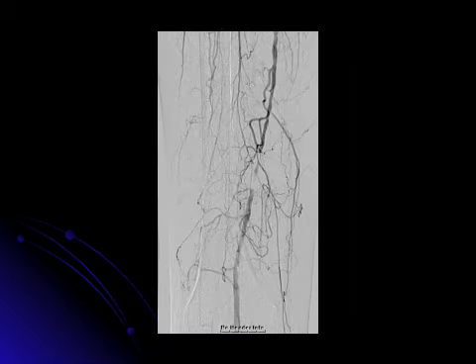The distal superficial femoral artery and proximal popliteal artery are occluded. There are large bridging collaterals to the mid and distal popliteal artery, and there is a 50% stenosis of the distal 1/3 of the popliteal artery. At the tibial peroneal trunk, there is a high-grade stenosis. The anterior tibial artery is occluded.